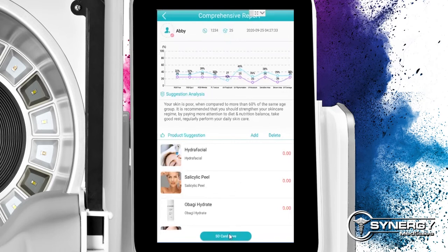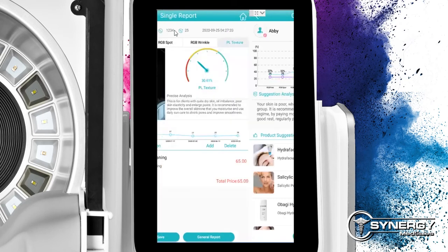Now, if I hit SD card save here on the bottom, it's gonna create a folder of all 10 skin conditions, as well as this comprehensive report. It creates a folder and saves it onto the SD card. On that SD card, we can remove it from the system, plug it into any desktop or laptop that we have at the office, and upload these patient files onto our computer. Therefore, we can share them and save them the way we would with any other document. So that's emailing them, printing them out, uploading them to a digital EMR. So that's a start to finish of a first-time patient.